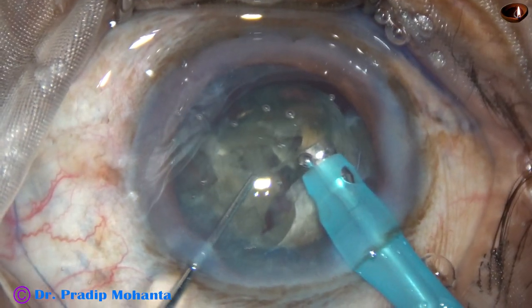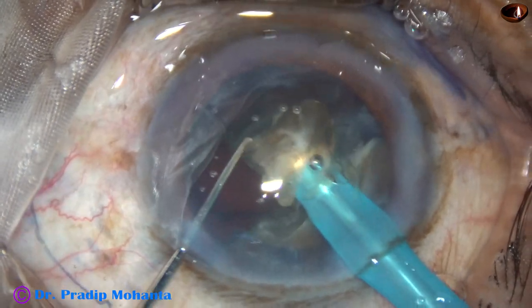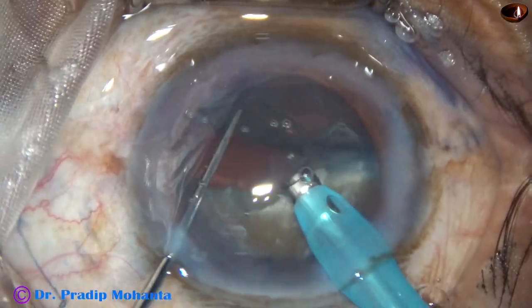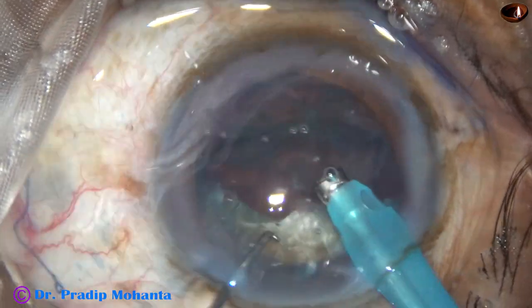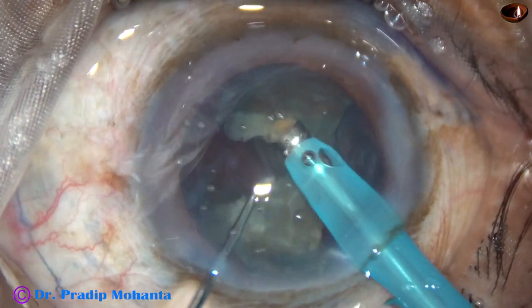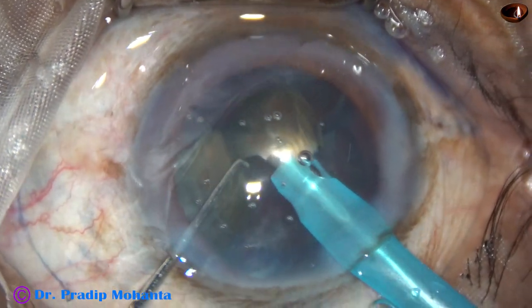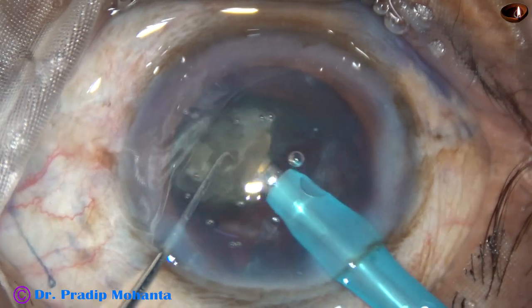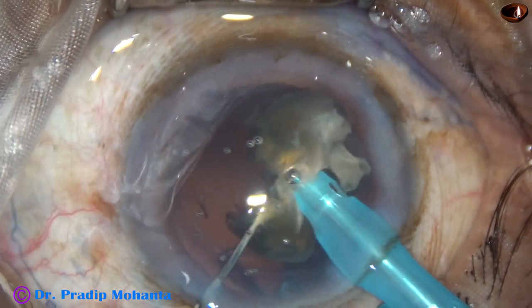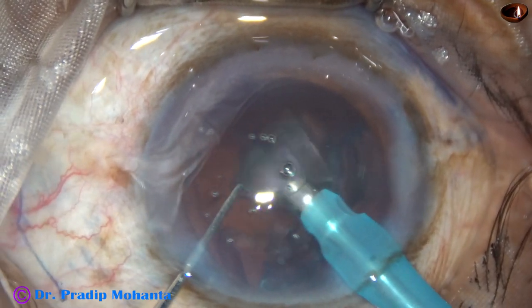The ultrasonic energy used in this case is 70%. Flow rate is 45 ml per minute, and vacuum is 450 mmHg. One hemi-nucleus has been managed. Now this is the epinuclear shell of that hemi-nucleus — let it support the capsular bag for now. The machine being used is Faros from Oertly. Faros has SPIP mode: when the tip of the phaco handpiece gets occluded and the machine is in SPIP mode, vacuum can be controlled by the foot switch.